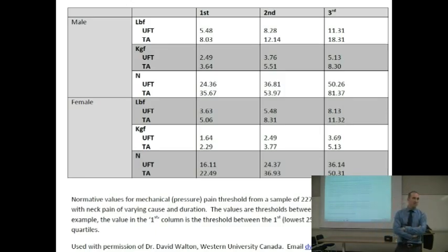I am a child of the 70s. I still think of pounds. That's the way I think. Even though we're supposed to be all metric here in Canada, you all know that you go to the grocery store and you still buy things by the pound. So that's just the way I think. So I tend to use pounds of force, but you might choose to use kilograms or newtons or kilopascals is another option.